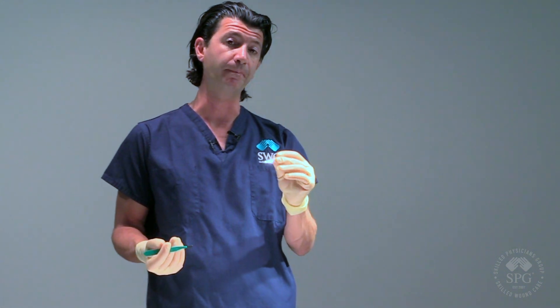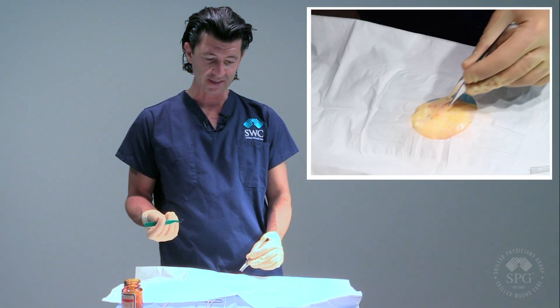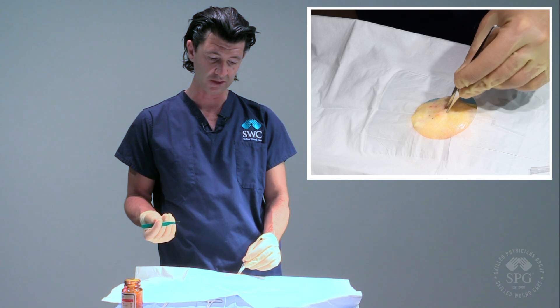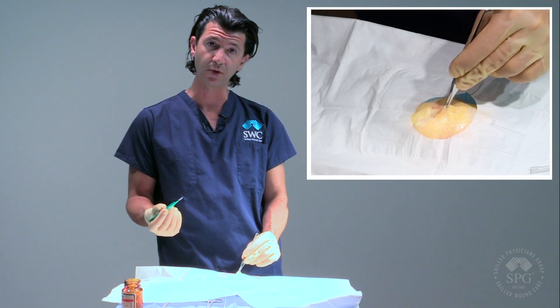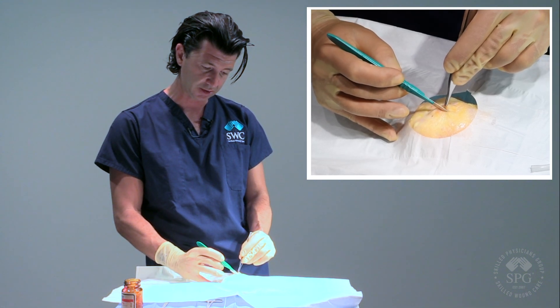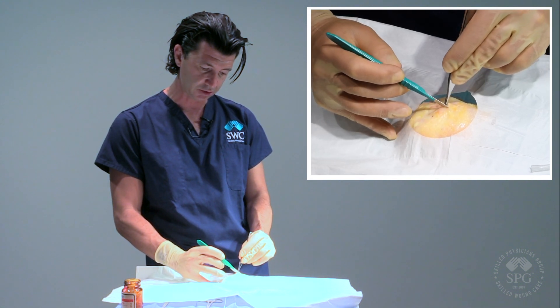These pickups have teeth on them. Forceps that have teeth will have a bit more bite to the skin, so you want to be careful, especially in certain procedures, but you definitely need them when working on the skin. Generally I'll find the area with the most fluctuance or the highest formation of pus, try to lift the skin to stay away from any vital structures, and then make an initial incision and go down until I start to see drainage.